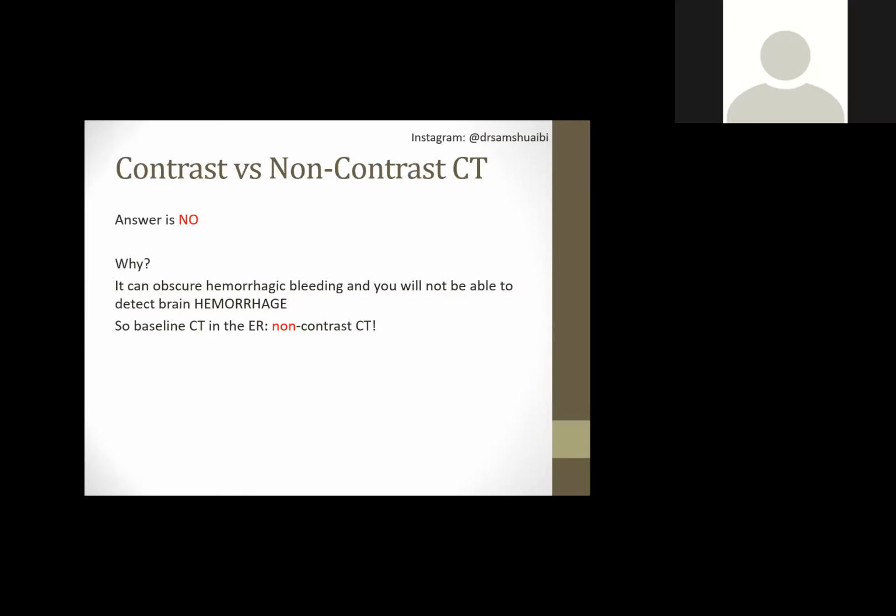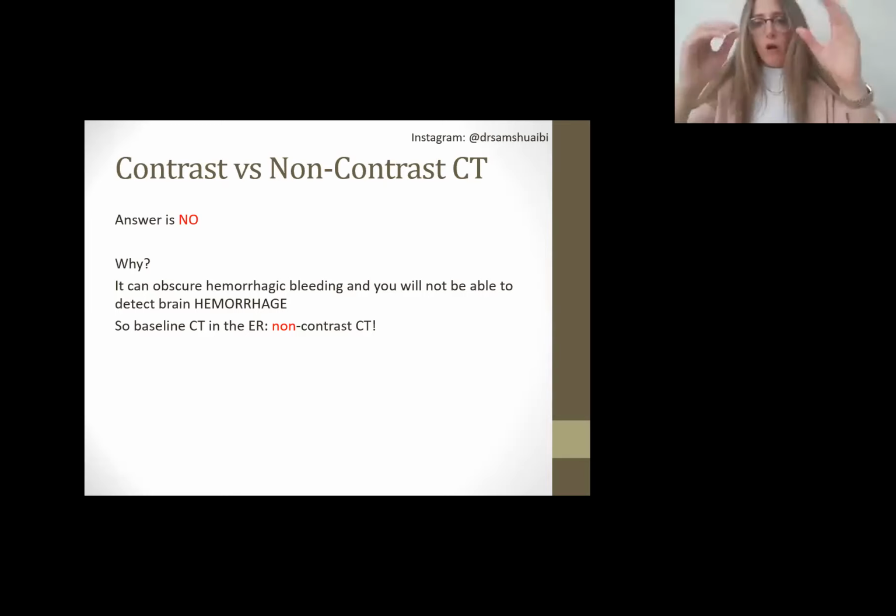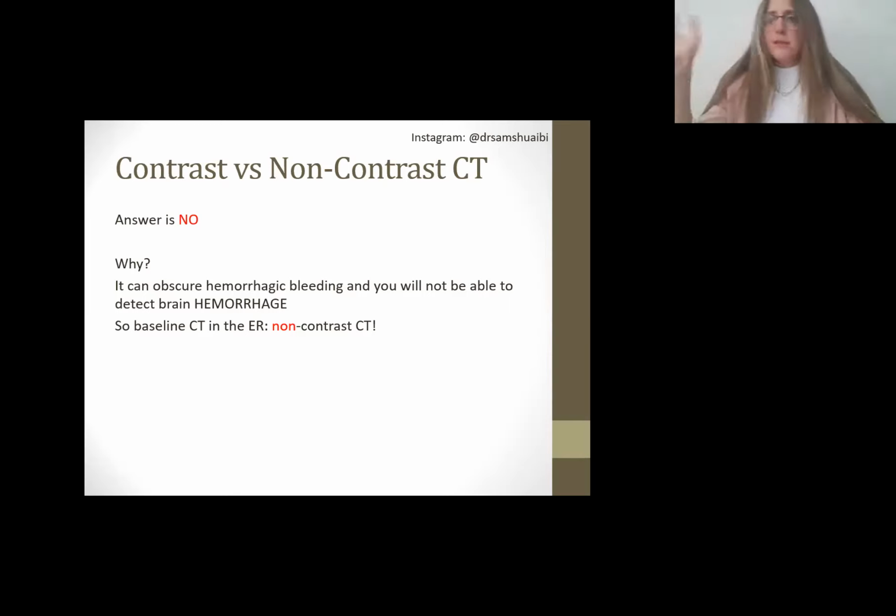The answer is no. Now, if you are suspecting any form of ischemia, or any form of neurological involvement, a central lesion, patient comes with neurological deficit, elderly, multiple comorbidities, and he's either unconscious or he's not moving some side of his body, the first thing to do, even if it was ischemia, is never give contrast CT. Always use non-contrast.